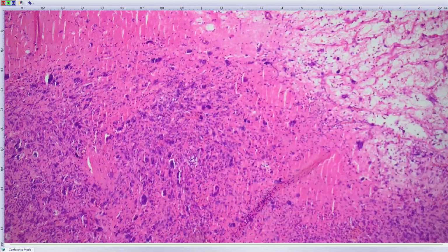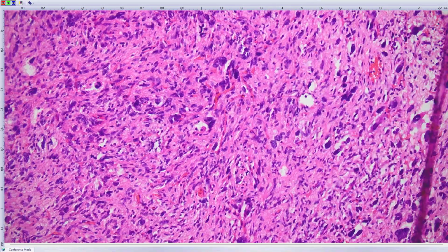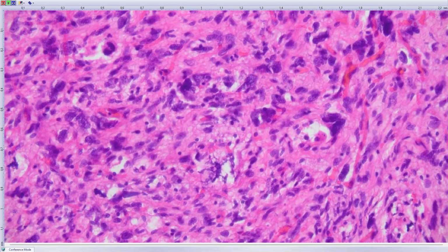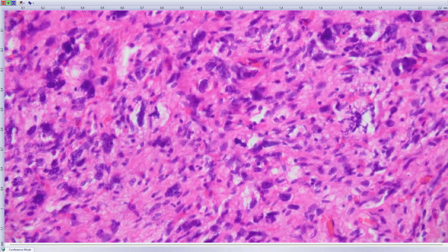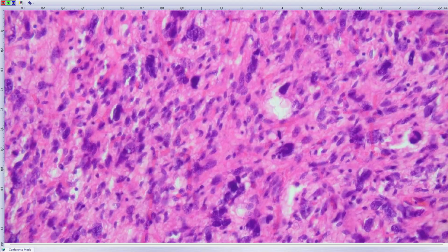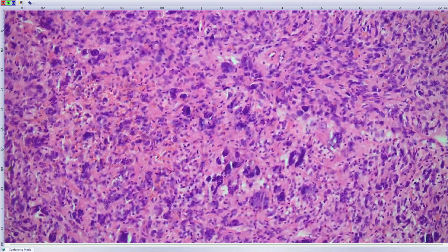But there is really bizarre atypia, which is not enough to call something a sarcoma, but when it's coupled with mitosis like that, if it's a mitosis, I don't know, it's probably it is. But there are many other more standard tripolar mitoses.